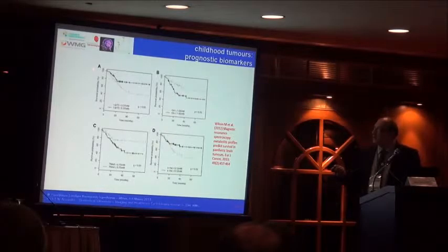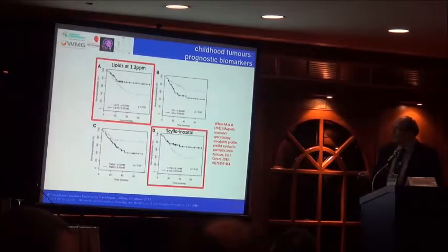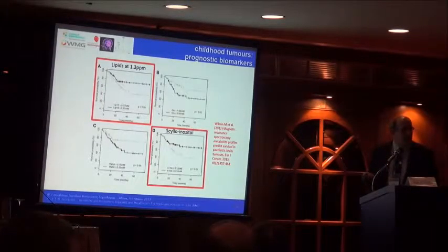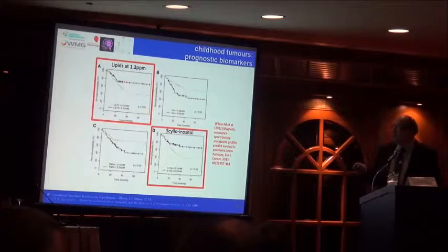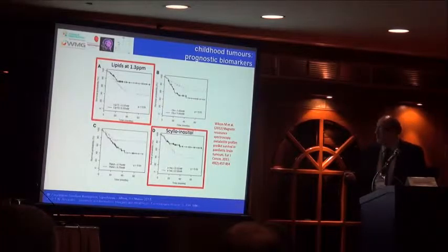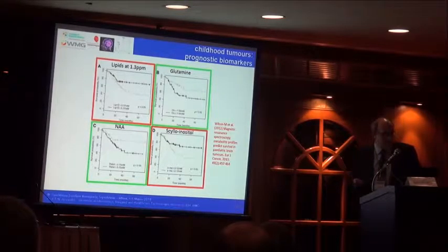And usually if the curve is like that, at the top, it means that the survivability is good, while if it goes down, it means that the survivability is bad. And actually, as I said, because we have learned a lot about the properties of this due to biochemistry, when we measure in vivo increased lipids at particular points of the spectrum, together with inositol, we have seen that these children don't survive, while when glutamine and NAA are increased, the survivability of the children is better. So we are able to say more about the tumor's behavior through the biochemistry and through the functional imaging approach.